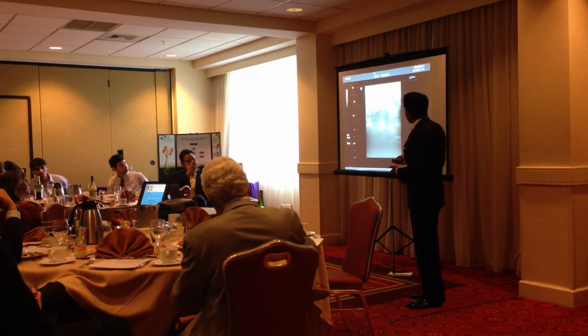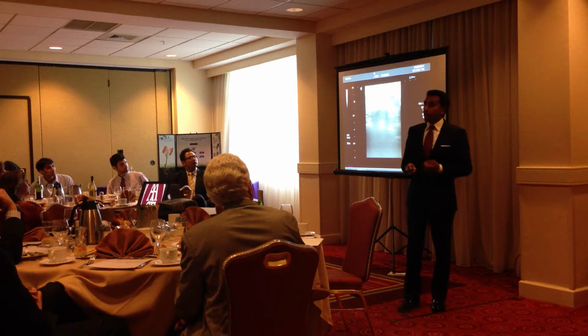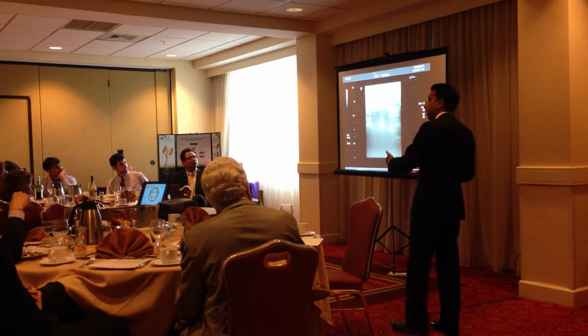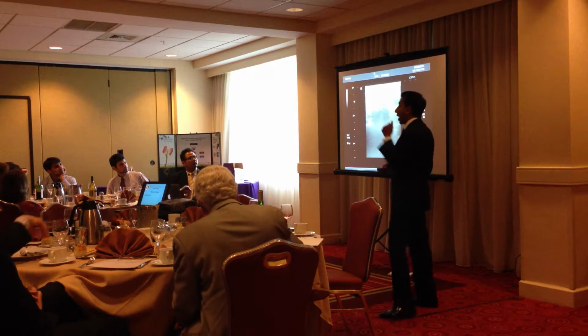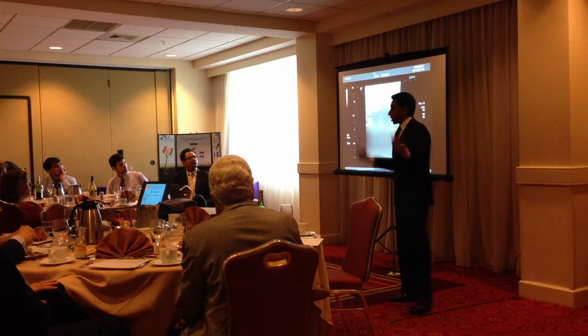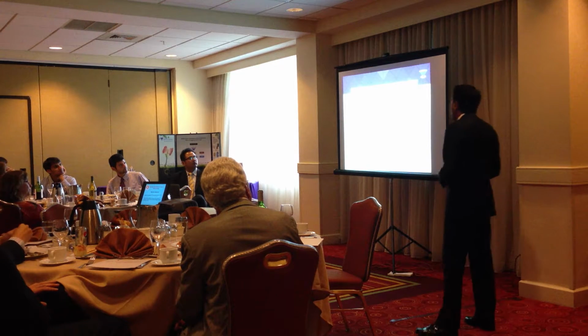The other thing I show about this is how quick this procedure is. This is not a procedure that is meant to be greater than 30 seconds. You're in, it's like a jackhammer, you're in, you're out. Because the goal isn't to show how beautiful the needle is. The goal is to actually procure a sample and put it on a slide.